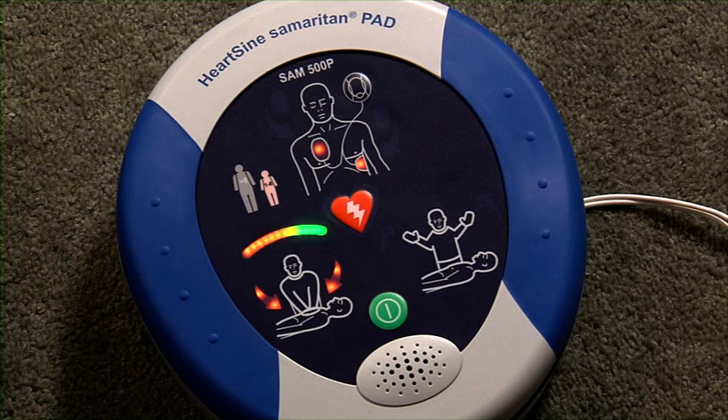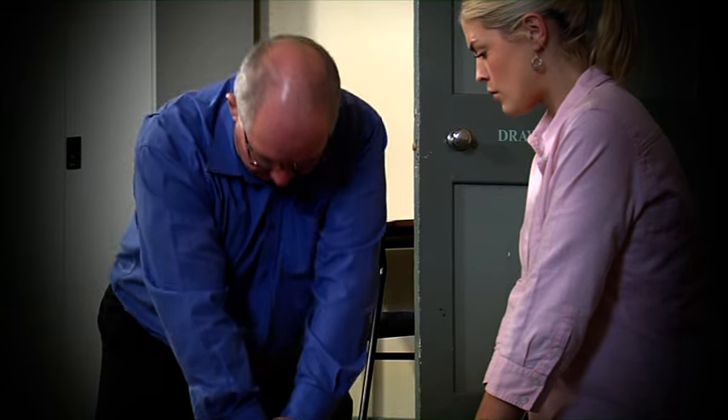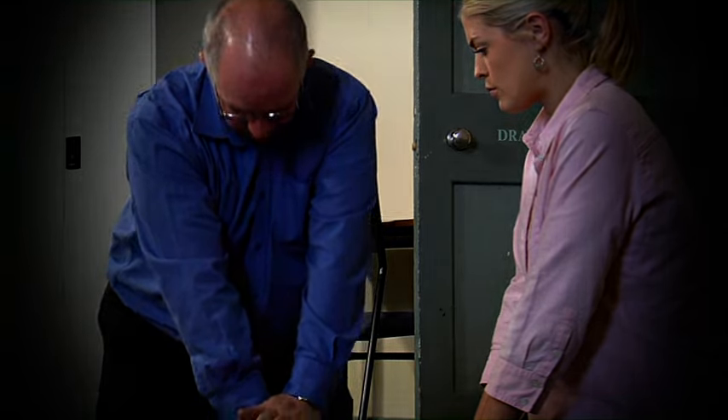Good compressions. Push faster. It gives feedback on the speed and depth of the compressions. These real-time prompts based on actual blood flow through the heart ensure you are performing effective CPR.